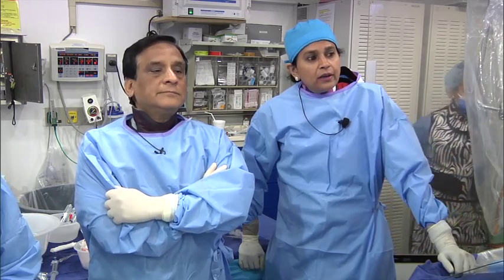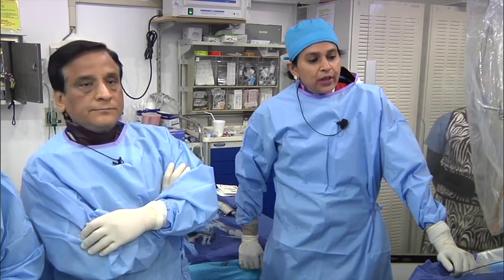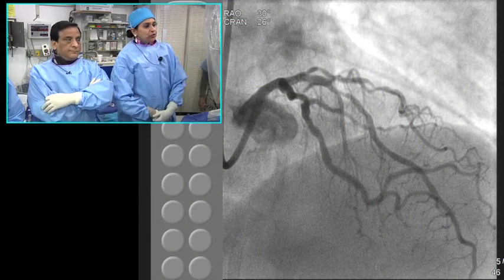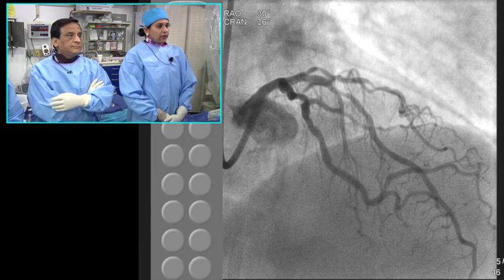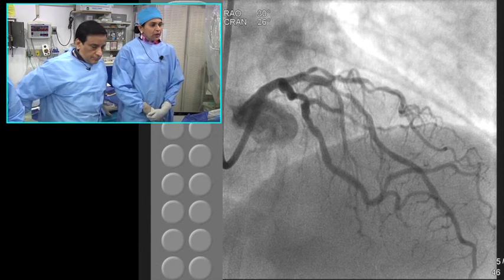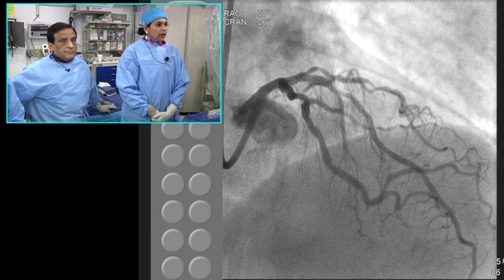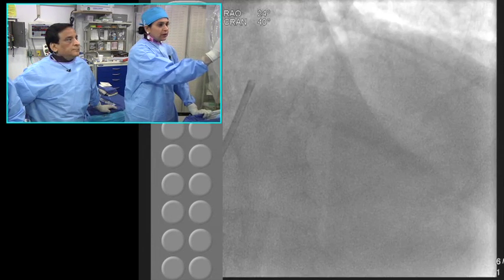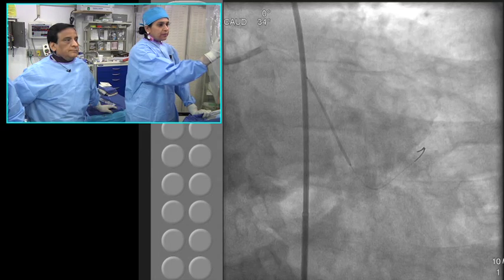No, the final words, just to tell you, I think the bifurcation stenting technique that we used here, if you go back to the cine angiogram, since we have 0,1,1 for LAD and diagonal, I think the best way to come out would be a V-stenting, where your carina, which is in the main, you place 2 stents at the same time, and your carina should be less than 2 millimeter, which we used here, which was right.